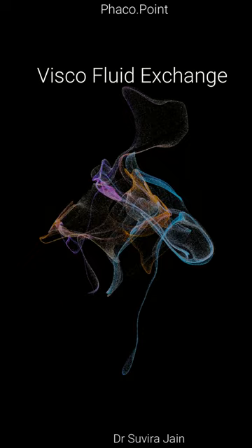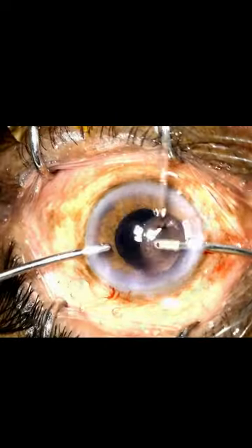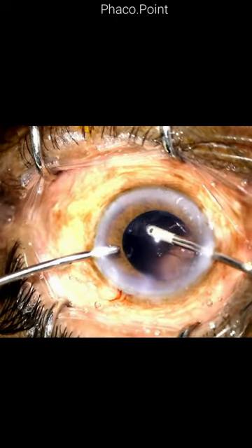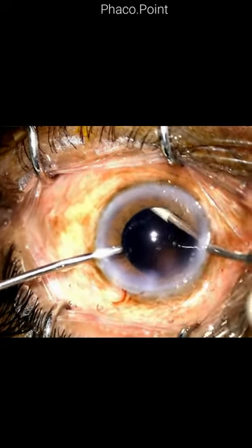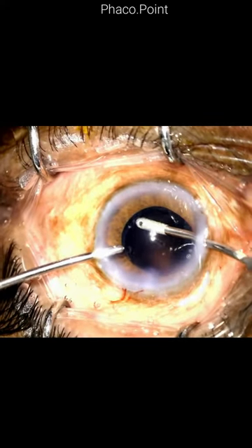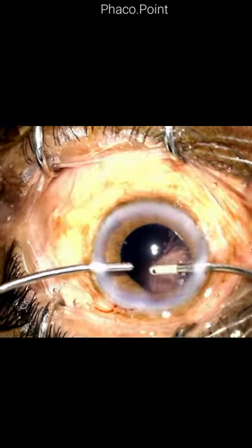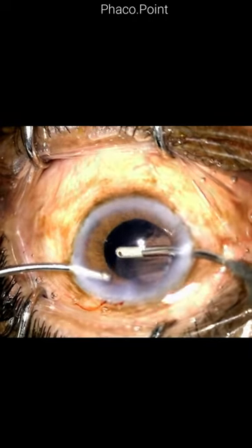Let's learn the technique of visco fluid exchange. I'm performing a bimanual irrigation aspiration and I'm about to complete the irrigation aspiration while aspirating the cortex on the left side. Before swapping hands over, I plan to do a visco fluid exchange, and here's how it's done.